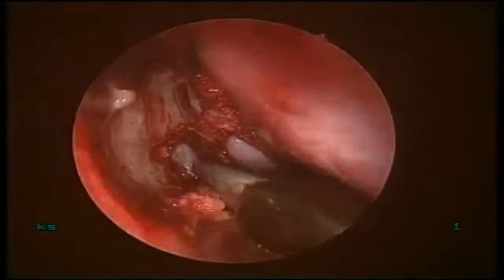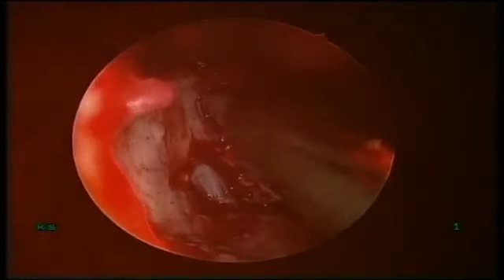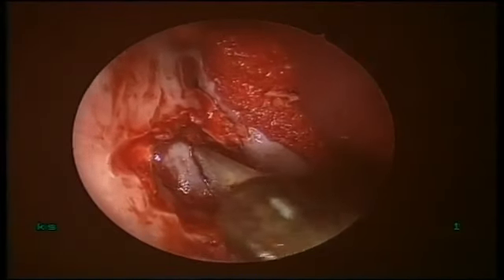Amazing. It will hold the bone perfectly, and then you can rotate, and the entire chunk of bone comes in one piece. That saves your time and energy. See the nasolacrimal duct?